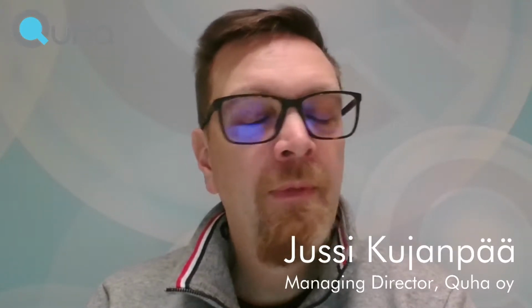Okay, the second question is, who would be a typical eyegaze and Zono user? I think there are two main groups. One group is users who have good head movements, for example some tetraplegic users, but who require either more precision, for example for design, or the applications are such that they are not compatible with gaze, for example games.